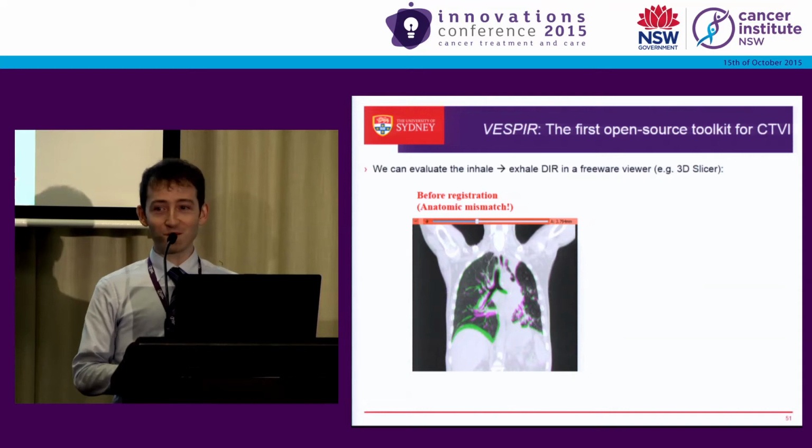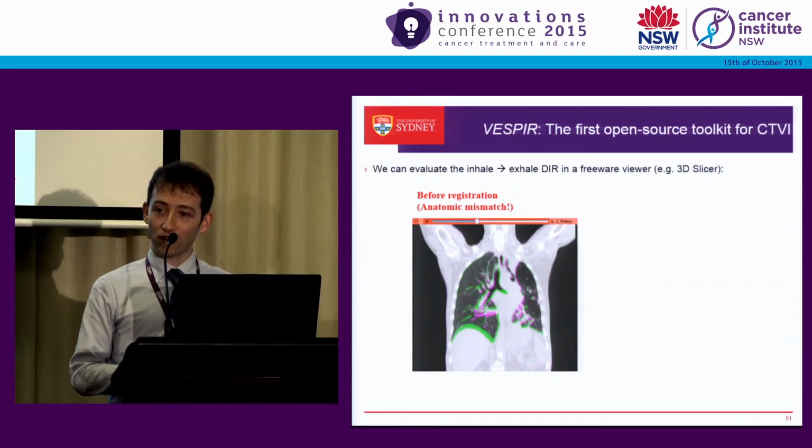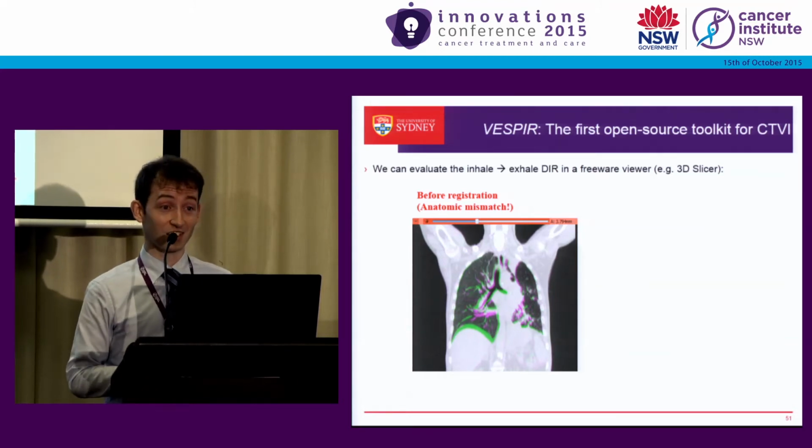Quality assurance, a really important part of radiotherapy. It's also a very important part of CT ventilation imaging. An advantage of this software is that you can export exactly the sorts of images you need to understand whether your deformable image registration is actually working.